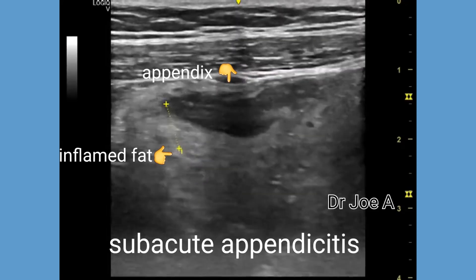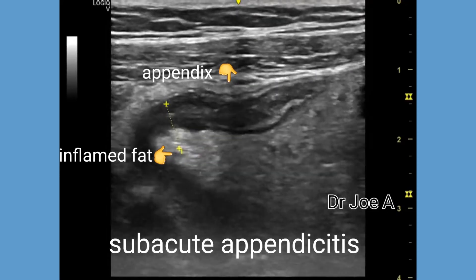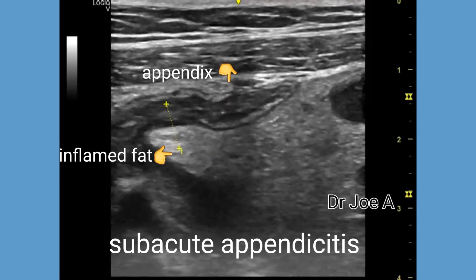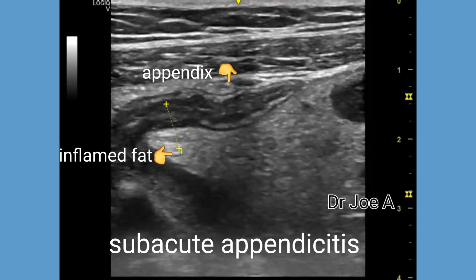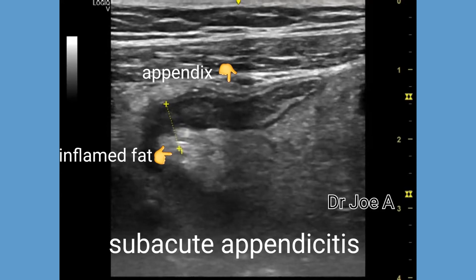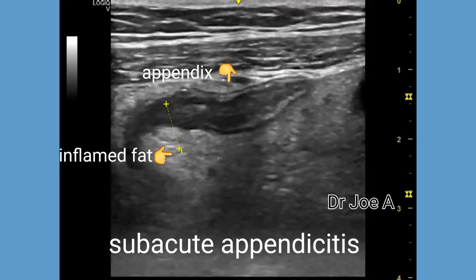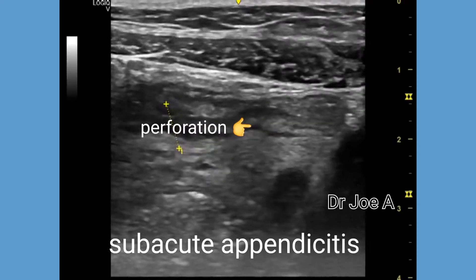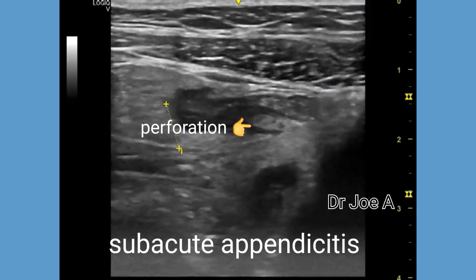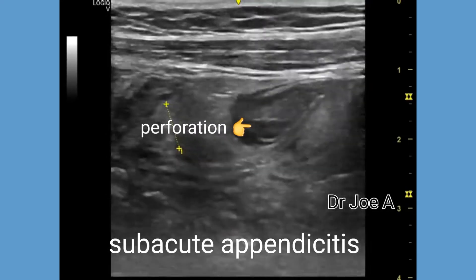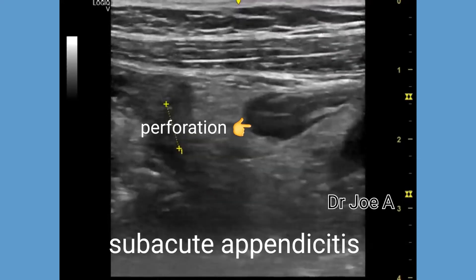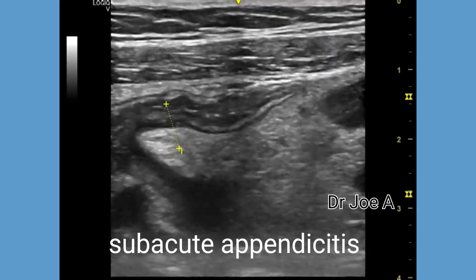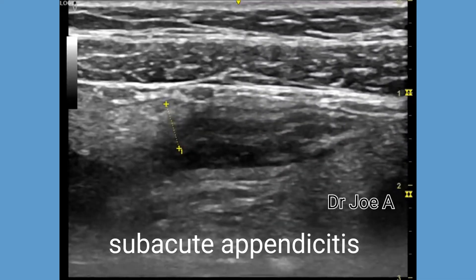Observe the inflamed fat posterior to the appendix, seen as echogenic tissue. There is also possible evidence of perforation of the appendix with leakage of fluid into the cavity, with surrounding echogenic fat which appears inflamed.